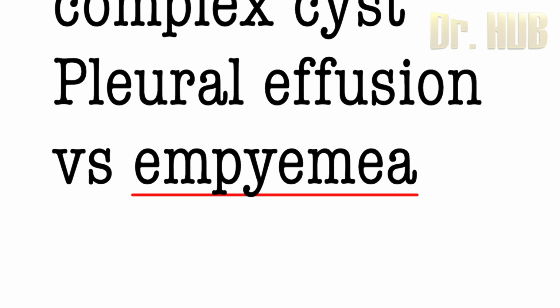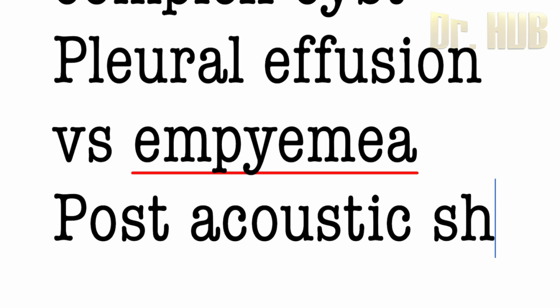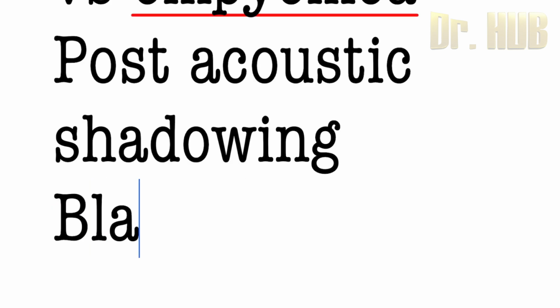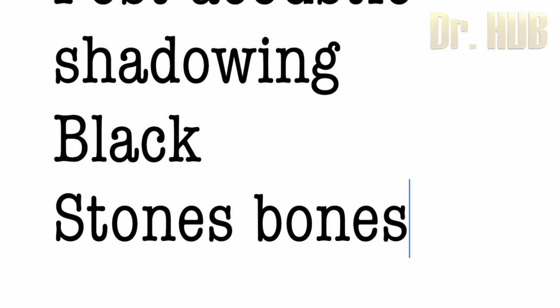Now looking at the posterior acoustic shadowing. In case of posterior acoustic shadowing, what appears black? Black will be the stones, then comes the bones as well as the presence of air.